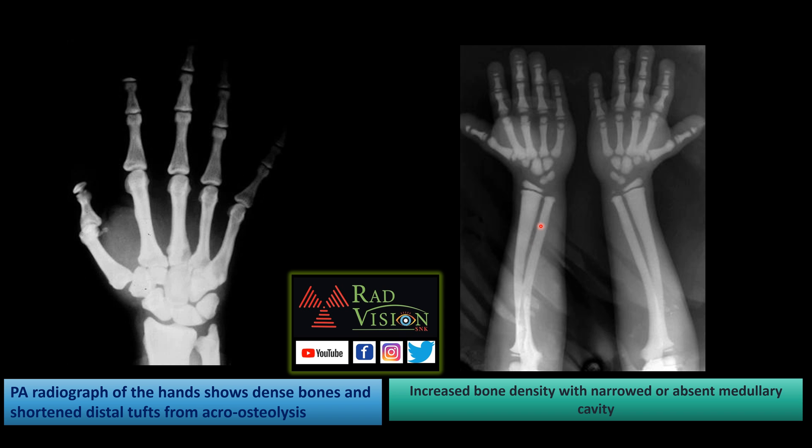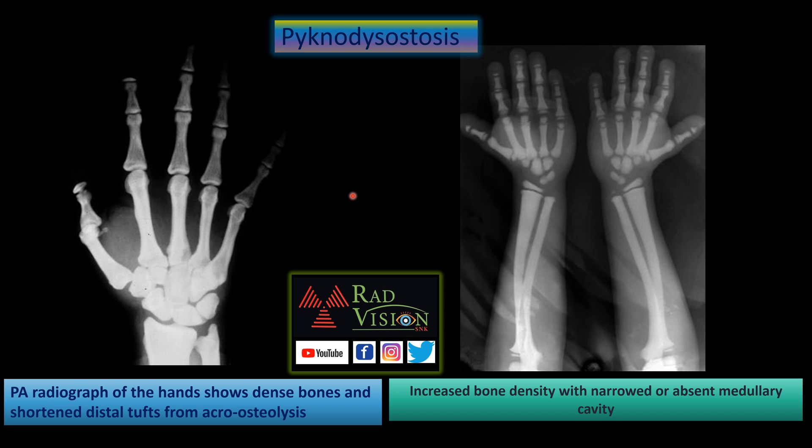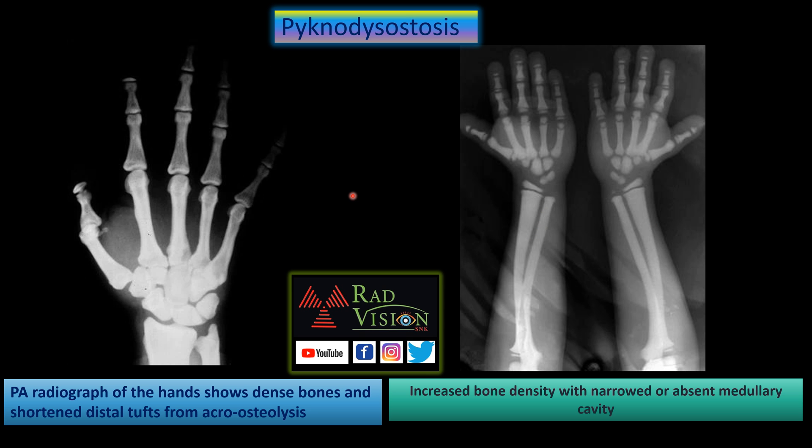There is increased bone density with a narrowed or absent medullary cavity. This is the classical case of pycnodysostosis. We will now look at the differences between osteopetrosis and pycnodysostosis.